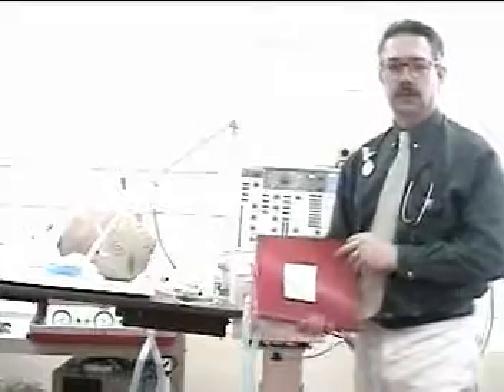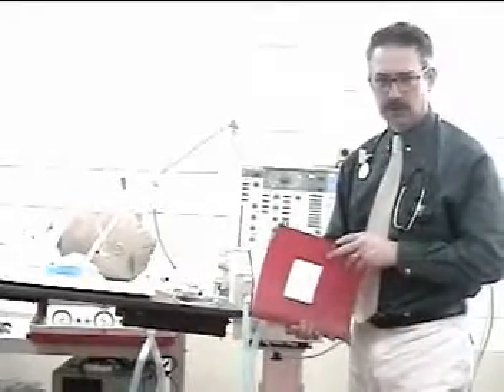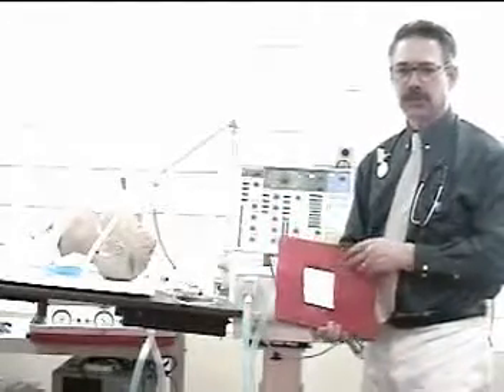This is the procedure checkoff for initiation of continuous mechanical ventilation using the Siemens Servo 300 ventilator.